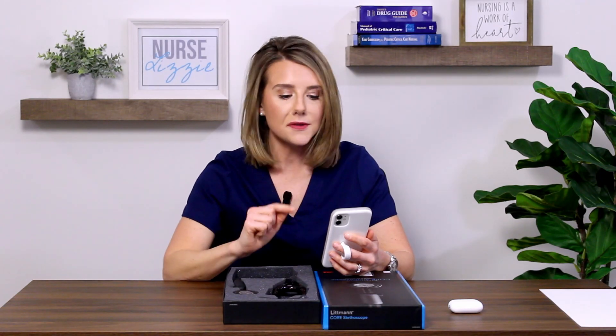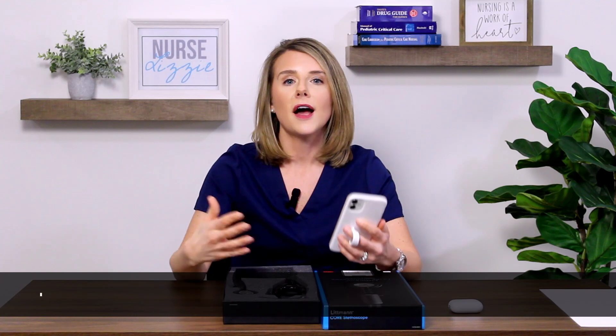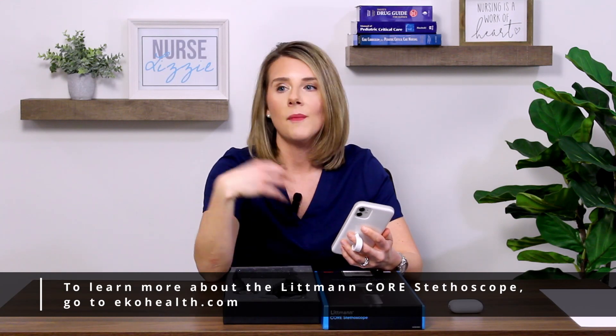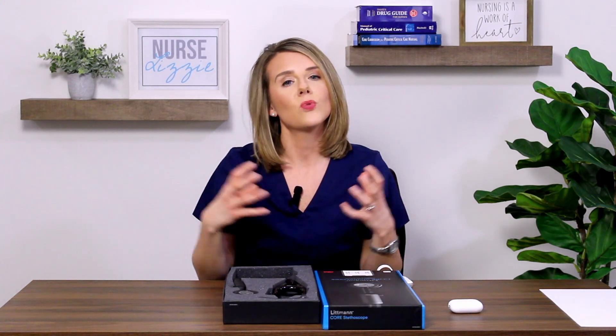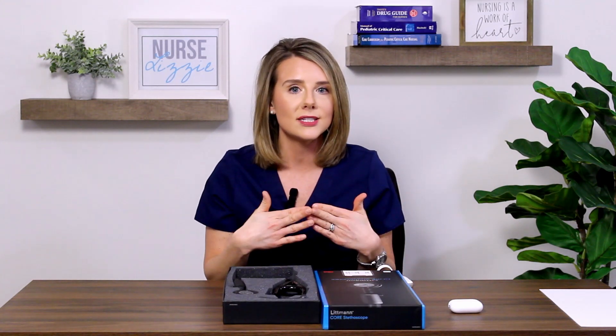Let's talk about one other feature from Echo Health's website that's really important. Through the use of AI and Echo software, the Echo app can summarize findings with an intuitive 15-second recording. The app is not going to diagnose disease, but it can definitely steer you in the direction that you're finding clinical findings that are significant and reportable. You could utilize this in a teaching moment — going through case studies, steering students into understanding signs and symptoms that may indicate disease, and building up a case study with a recorded murmur in the classroom setting.